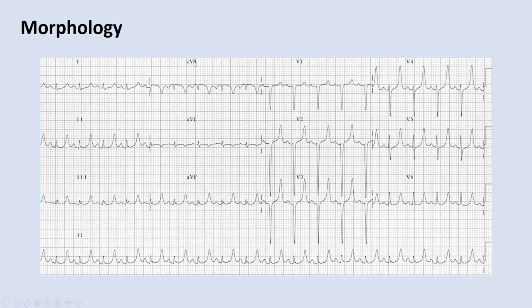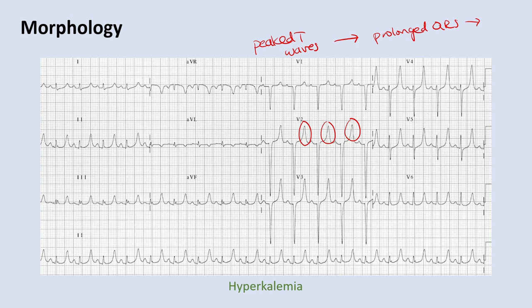This EKG shows really peaked T waves, which is a sign of hyperkalemia. As hyperkalemia worsens, you'll start to get a prolonged QRS, and eventually it turns into a sine wave pattern. At that point, you're too far gone — potassium should have been treated much earlier. Make sure you know about peaked T waves as the early sign of hyperkalemia.